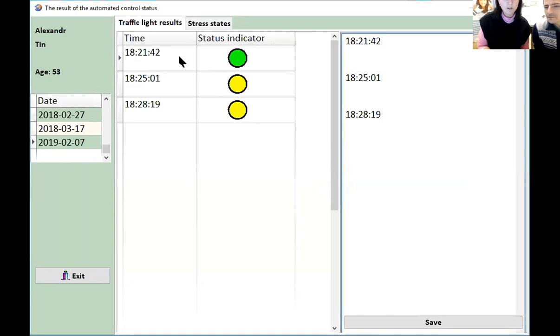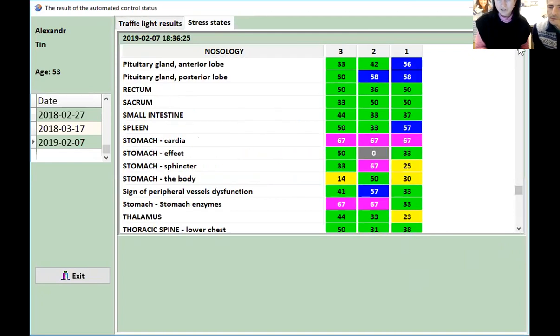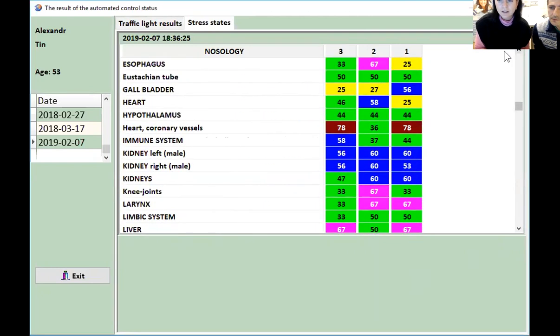This is the time when the measurement was done during this treatment. From the beginning, he had 6. Then in about 3 minutes, he had number 5 and then 4. You see it going down, so the body uses energy. He is losing this energy to treat something, so actually it's good that we were treating him. But you go down to stress states, and here you can see everything that you can measure. You search for these overactive organs. Heart: you see it's high, low, high.